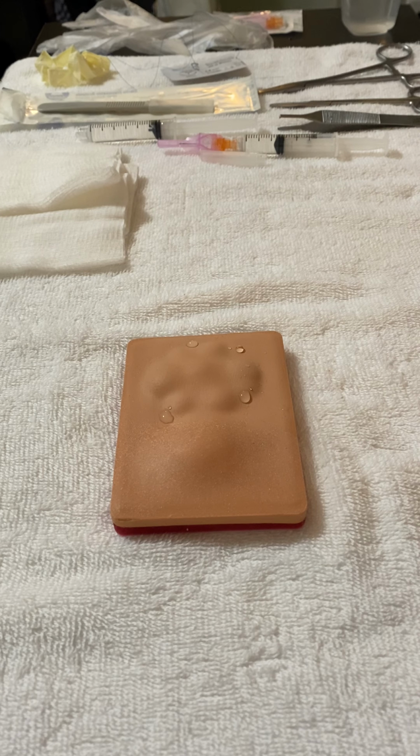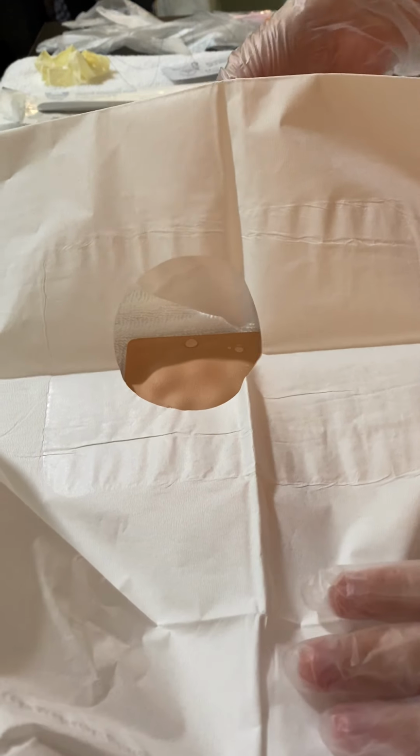And then for this portion, I would set out my drape over the area that I'm working.